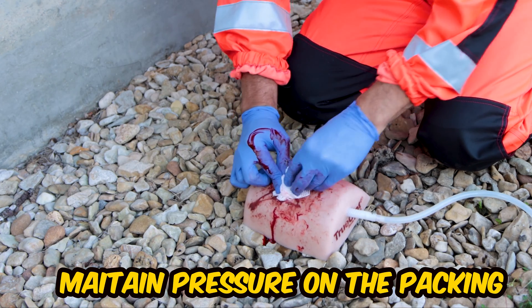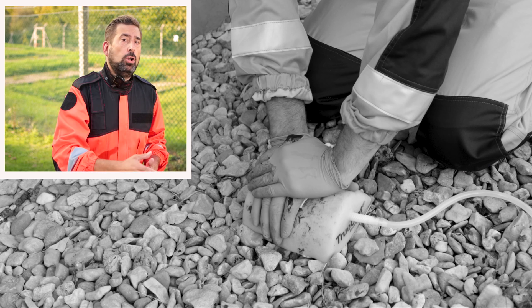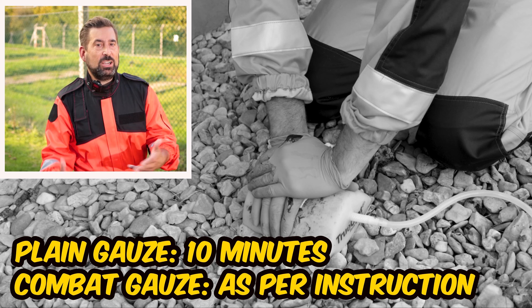Once the wound is packed above the skin level, maintain pressure on the packing. The length of time depends on the product you're using. If it's just simple plain gauze, PHTLS suggests 10 minutes of continuous pressure. If it's combat gauze, you need to follow the manufacturer's instructions.